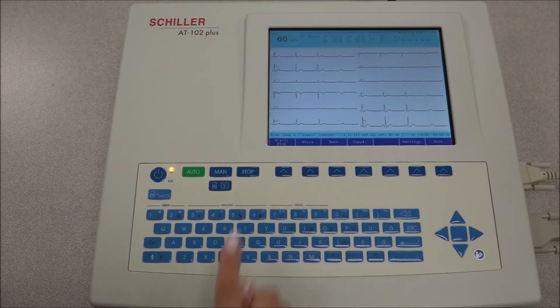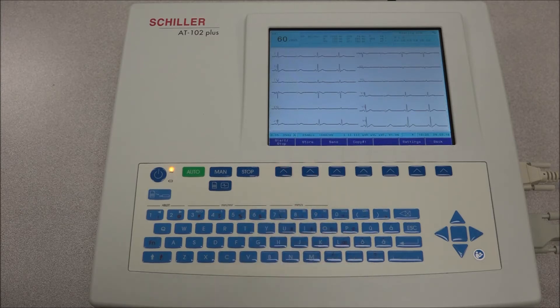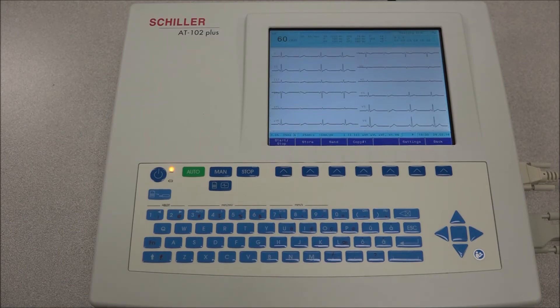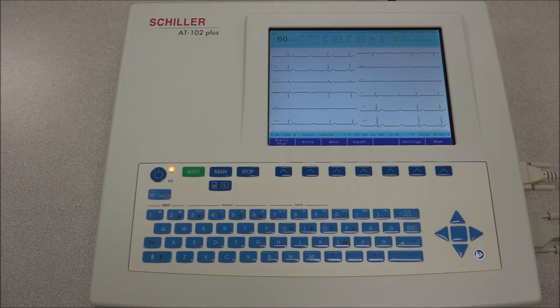Press the START STOP icon. The recording starts and the duration of percentage is indicated in the message bar. The recording will continue for the duration defined. When the time defined has elapsed or the recording is manually stopped, the recording is stored, sent, or printed according to the defined settings.